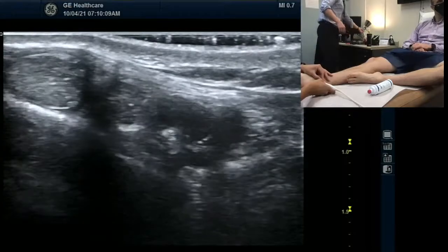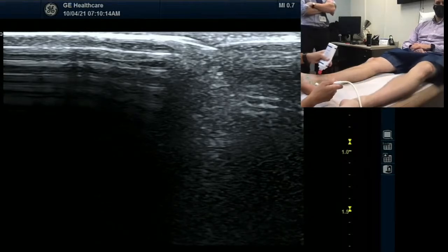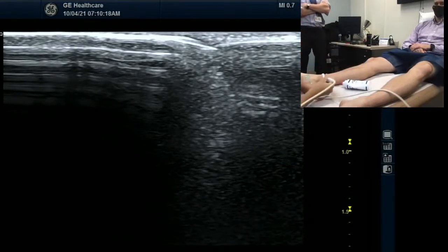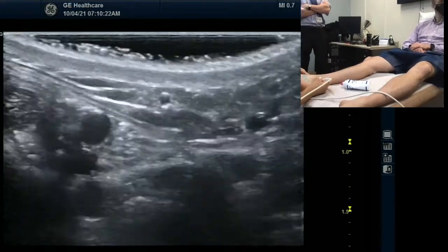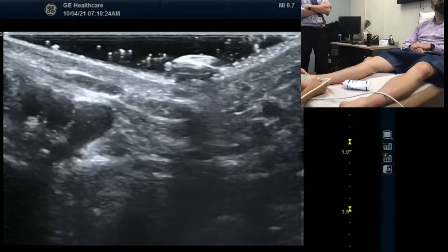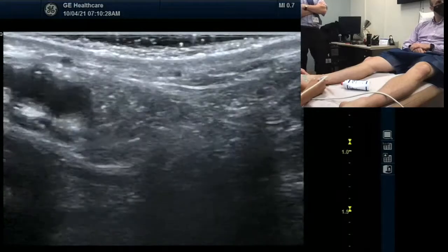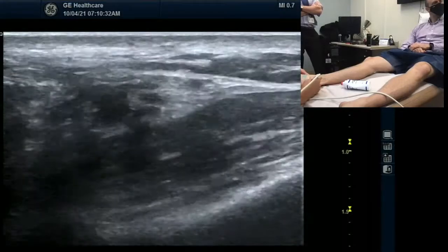Can you put more gel? Generous amount of gel for you. It's not icing on a cake. Alright, so we're going to trace the tibial nerve today. Come down this way. Tom, Dick, and very nervous Harry.